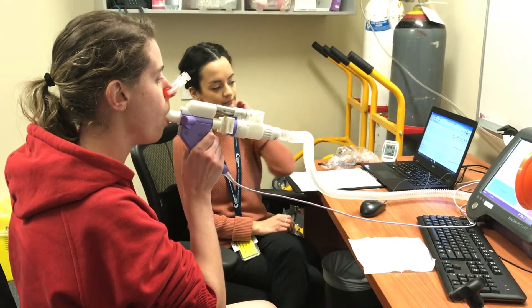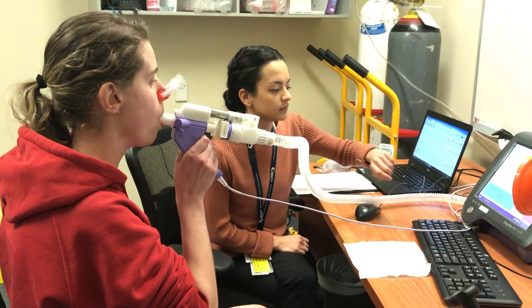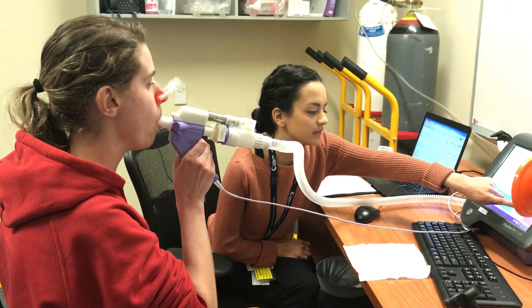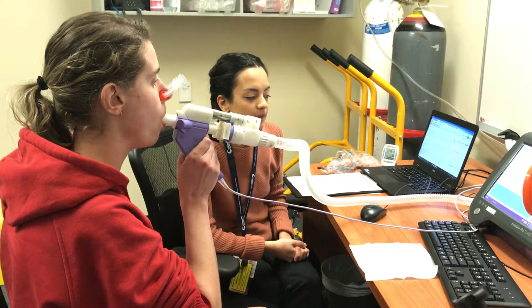Nice and relaxed. Alright, lovely, Esther. Just aiming for that light grey area now and breathing all the way out until you're empty before taking another breath in.